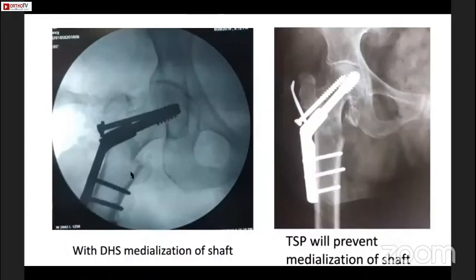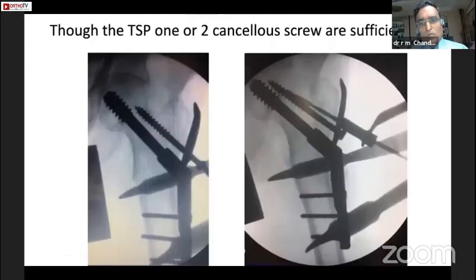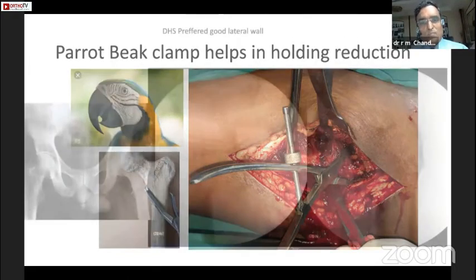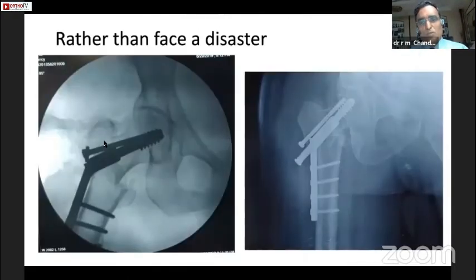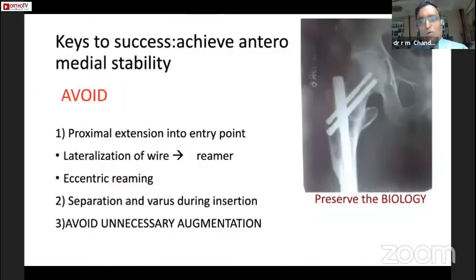Dr. Chandak, let us stick to PFN. Yes, I'll conclude with PFN, sir. So this was augmentation with the DHS, in a fragile bone.